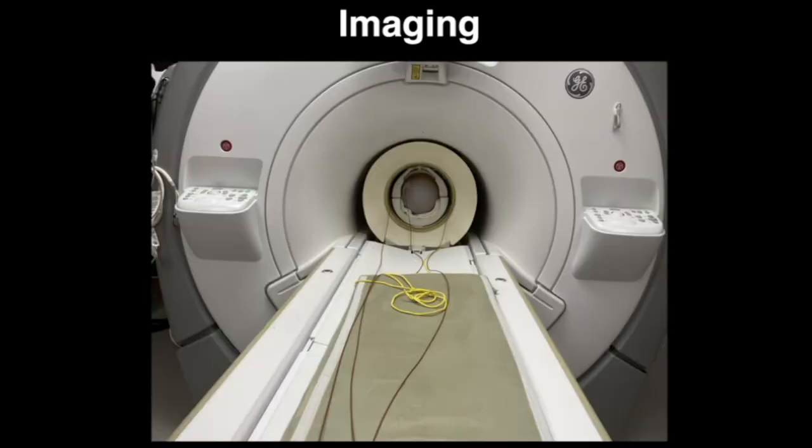But with the local gradient put in, you can see how much of that imaging volume you lose. Right to left, that's again 60 centimeters. But with the local gradient put in and the RF coil, that's about an 18 centimeter phantom in there. So you're left with about 20 centimeters of real imaging volume. That's the price you pay, but in return, you get a lot of speed in terms of being able to switch your fields and acquire functional data much more quickly.